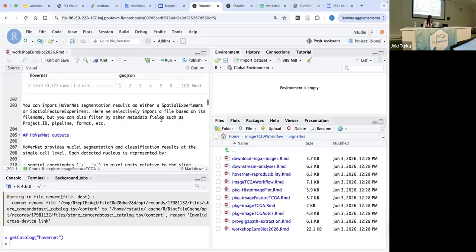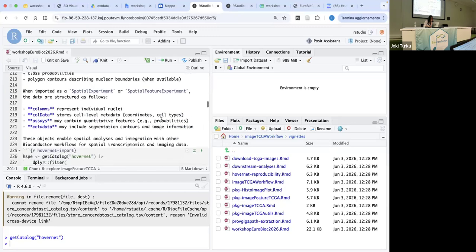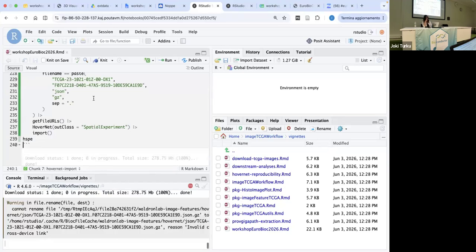Okay. It's working now in your R? Okay. So that would be tricky because, let's see if it works. Before we went out of memory, so we require more RAM on these RStudio sessions. So if they manage, we make it.